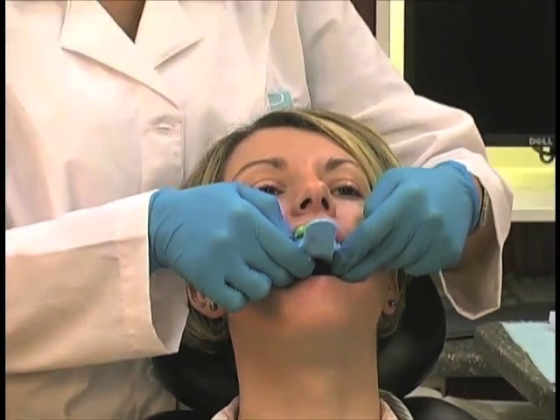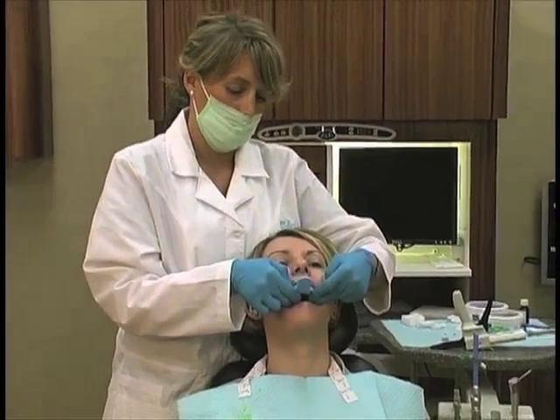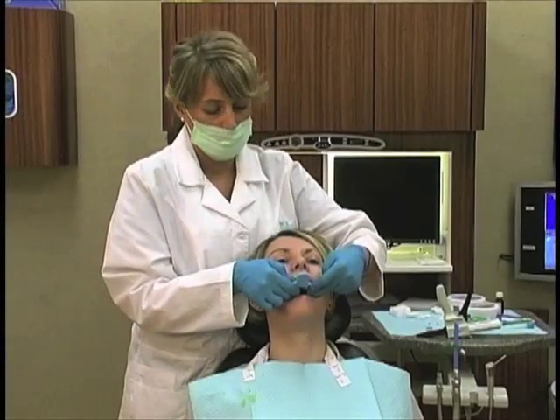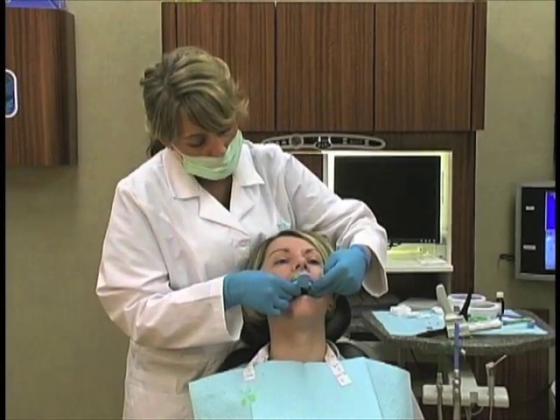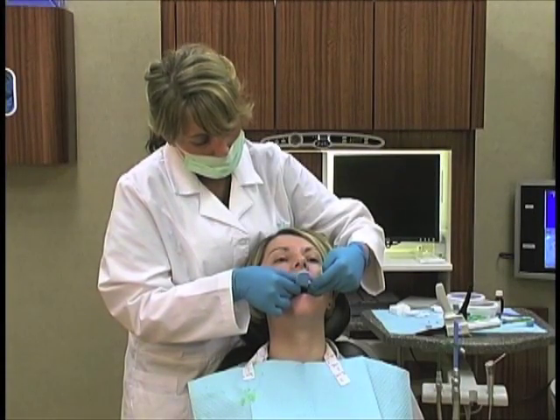And then we're just going to wait our 2.5 to 3 minutes for setting. Again, we're going to be checking with not just time, but with our fingers, and remembering that it's the putty that tends to set up last.